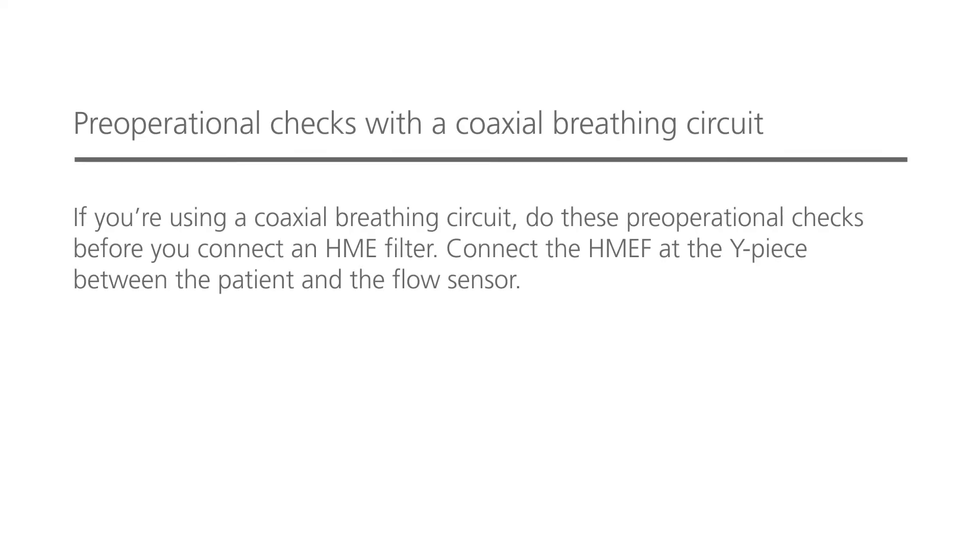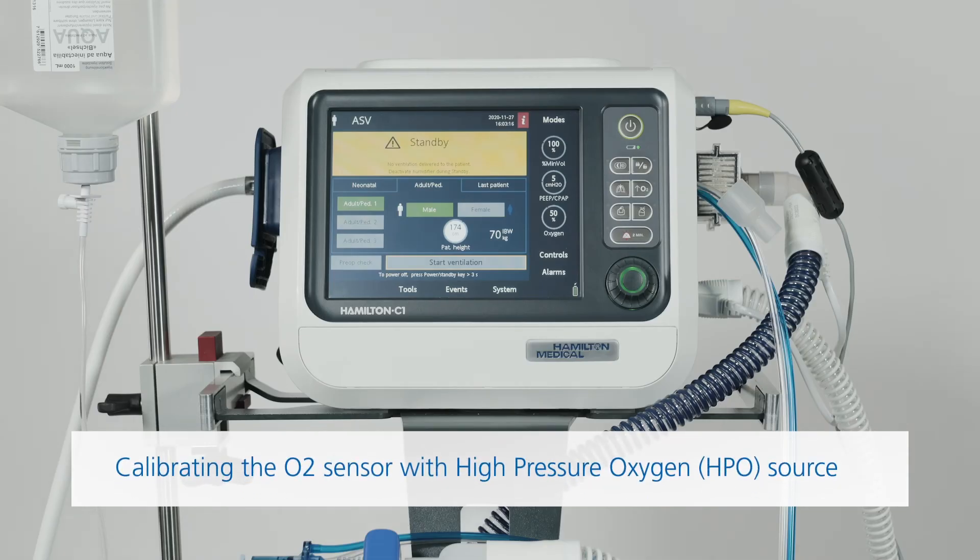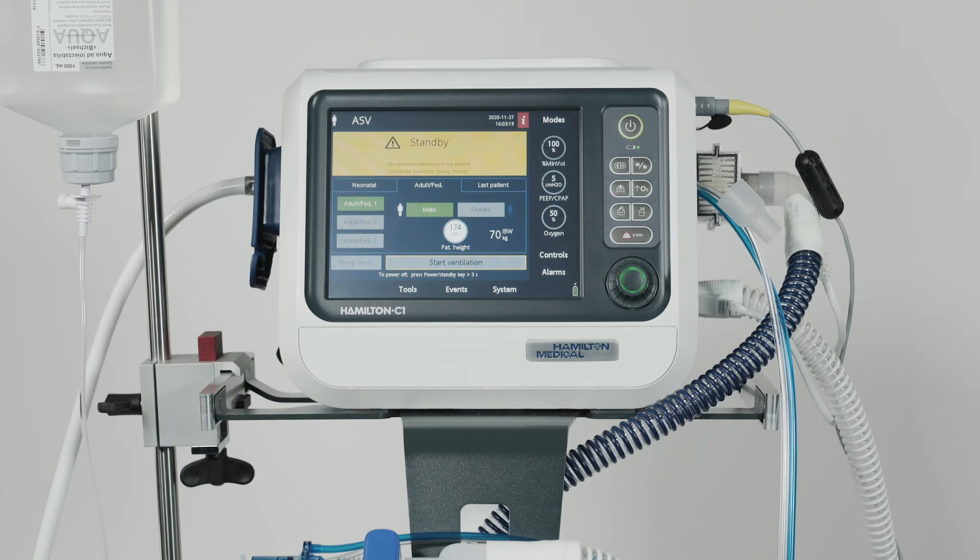If you're using a coaxial breathing circuit, do these pre-operational checks before you connect an HME filter. Once you've done the test and calibration, you can place the HME filter between the patient and the flow sensor. You only need to calibrate the oxygen sensor if a red X is displayed in the O2 sensor checkbox or if there is a related alarm. You can calibrate the sensor either when the ventilator is in standby or during active ventilation.